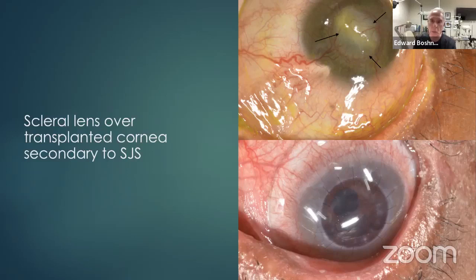That central area, this patient's from another country, that cornea perforated. The doctor used crazy glue to seal up the perforation. The patient came to Miami to have medical treatment done. We fit that eye with a scleral lens to protect it in anticipation of a surgical procedure that was to be done here in Miami.